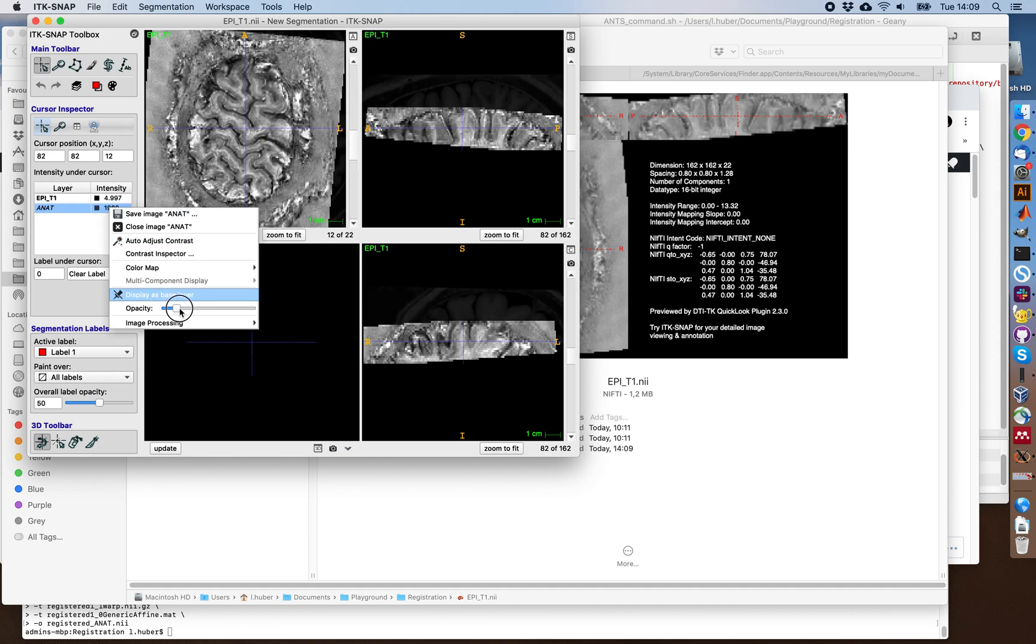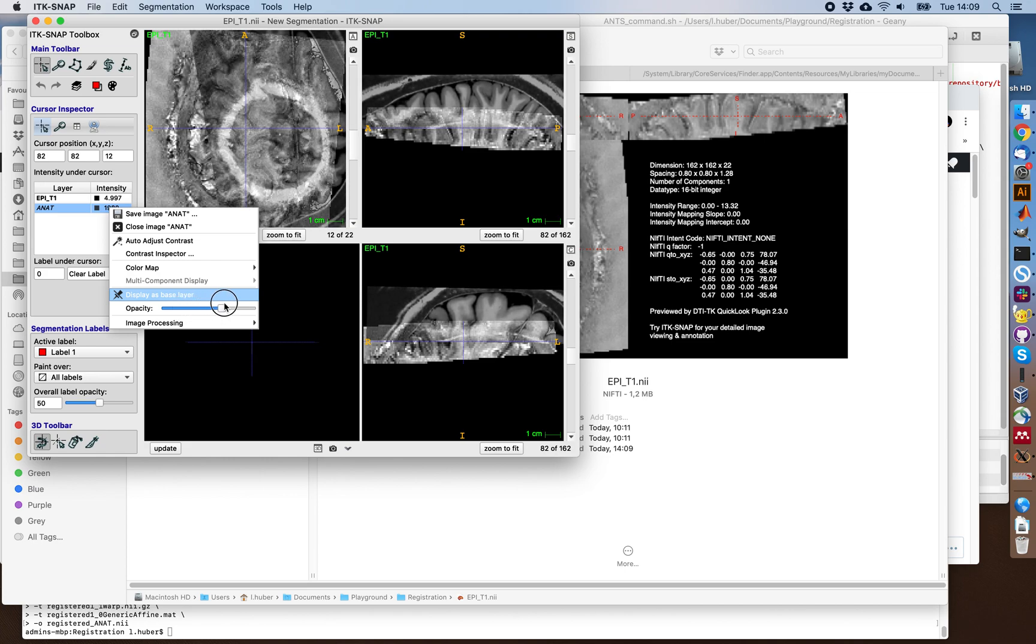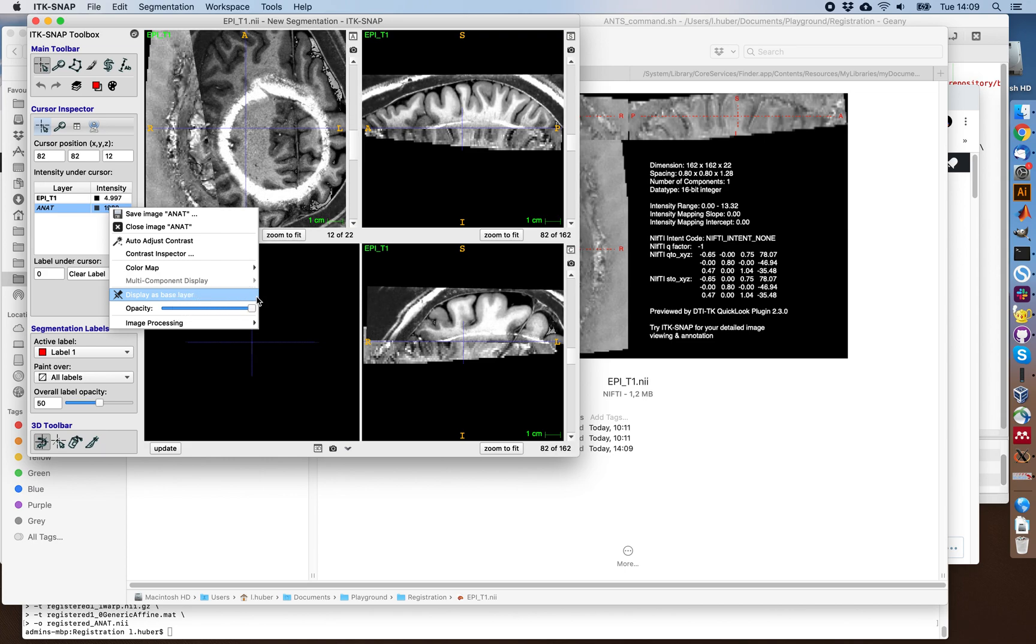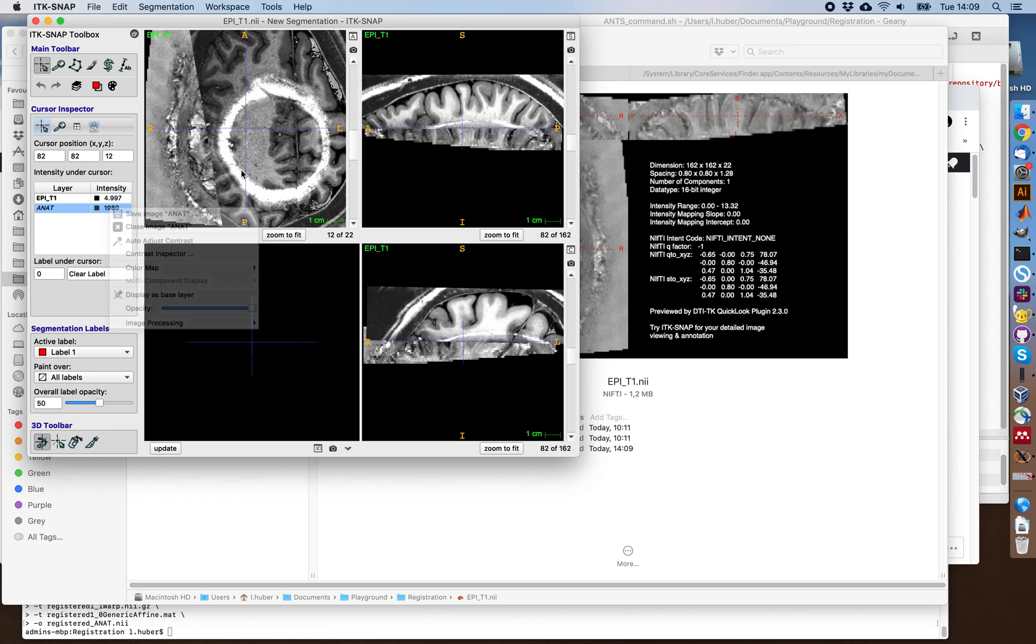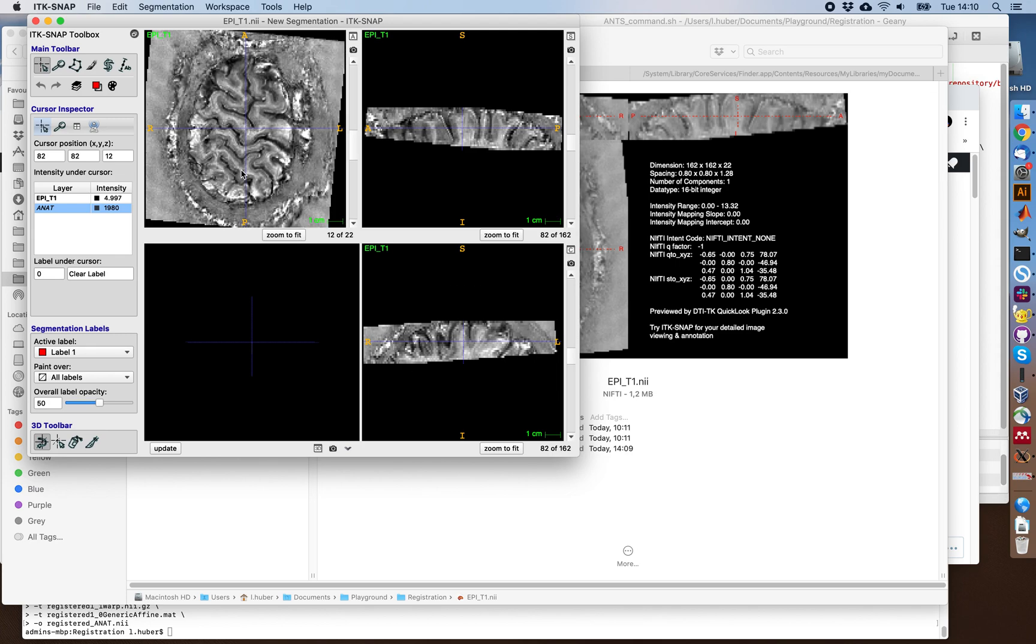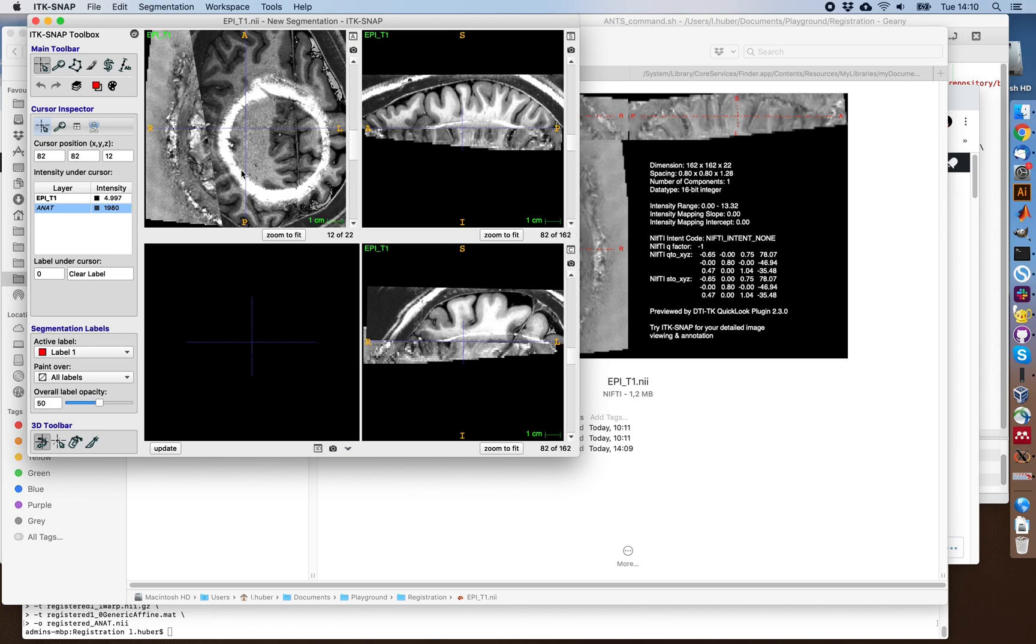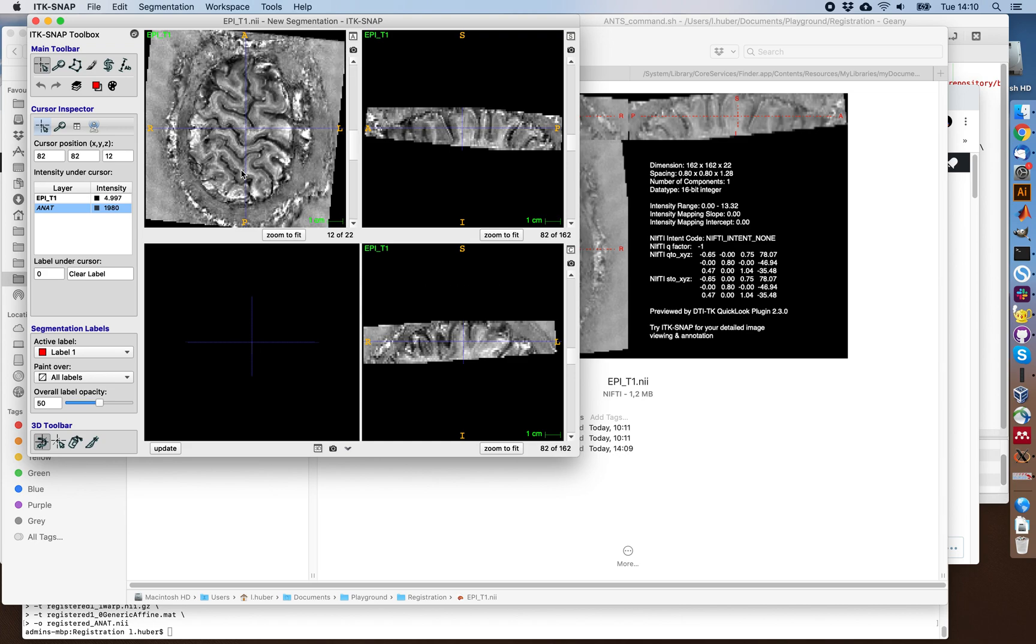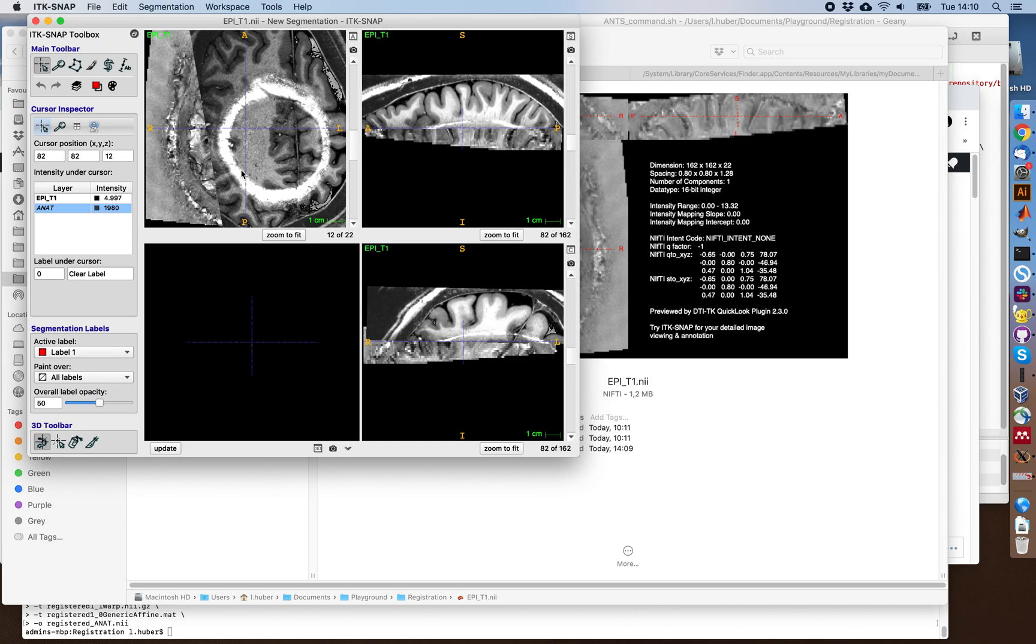This for some reason has very low opacity. You can switch between those views by hitting the W button like this. And you can see that those are in a very different space. So we need to register them together.